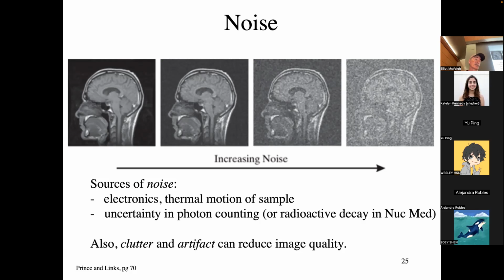The fascinating thing about magnetic resonance is if you take that antenna and pull it away from the patient and make your noise measurement on your scope, right? And remarkably, you're in an RF box enclosure. No RF gets in this room. So you look at your noise, and now you take that and put it on the patient, the noise goes like this, right? So the patient is noisy. The patient produces random thermal motions of charged particles that give you the noise, and that's the primary source of noise.